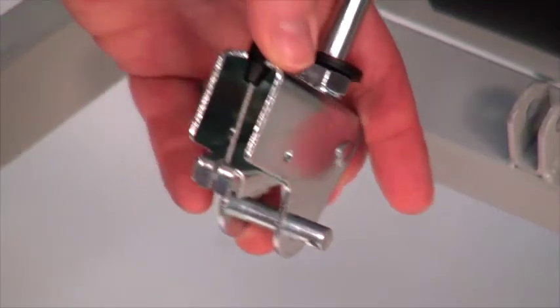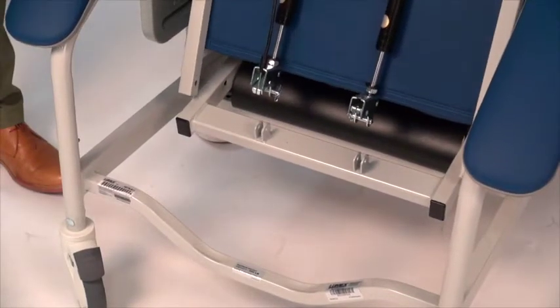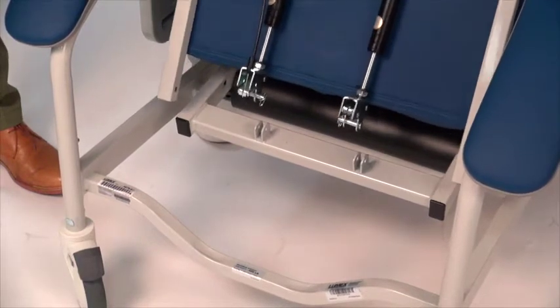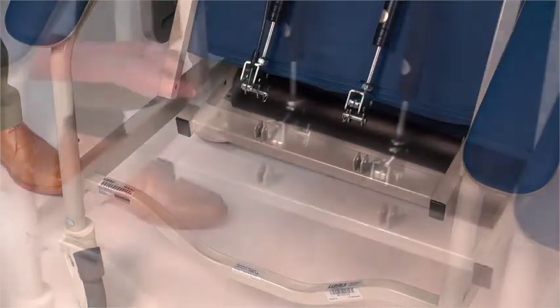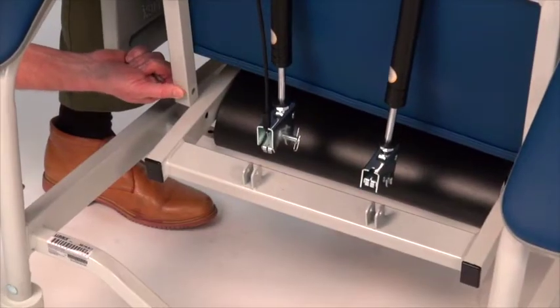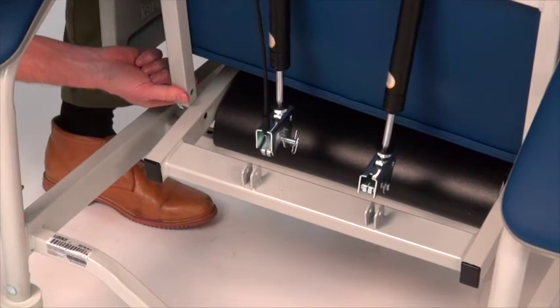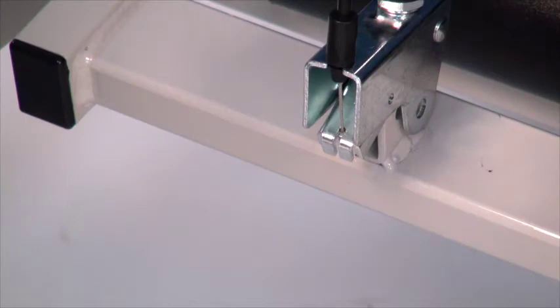With help, align the holes on the back with the holes on the recliner frame. Prior to assembling the back to the frame, utilize the break-free wipes on the bottom of the back posts and the frame. This will make aligning the holes in the back posts and the frame easier. Lift the upholstered back from the sides and place it horizontally with the upright back tubes resting on the recliner frame.